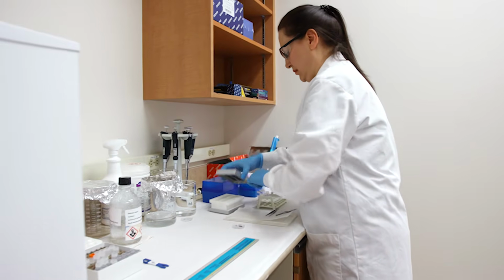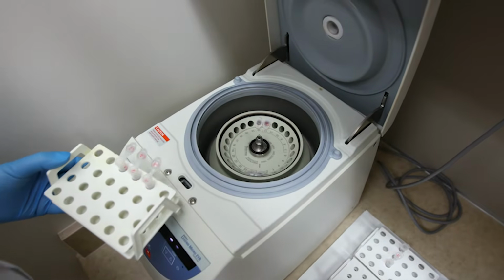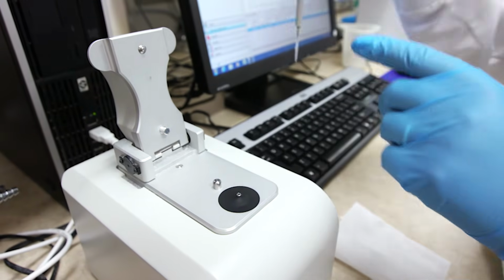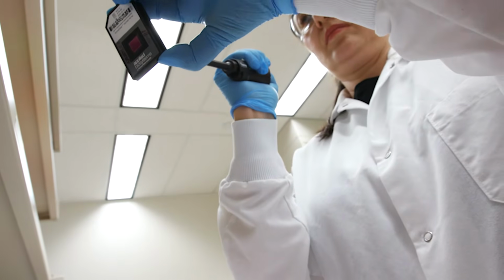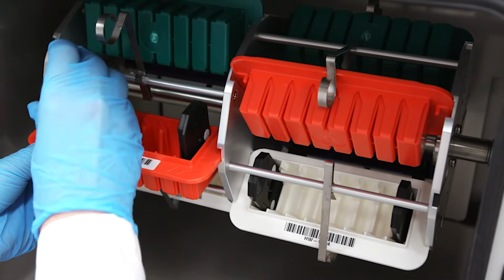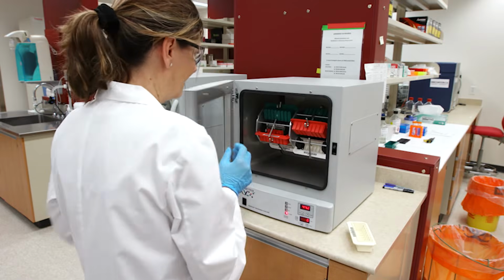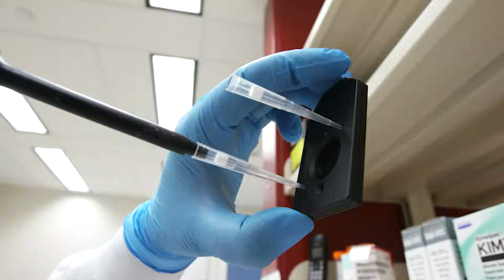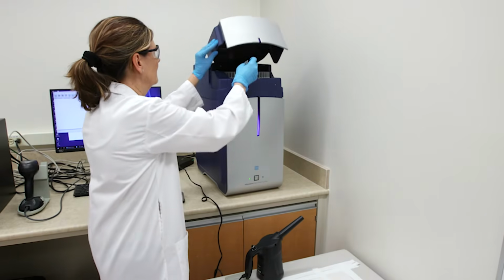We then take that sample, elute the RNA, clean it up, do some quality control tests on it, and then fragment it. So we break the RNA apart into all these little pieces, and then we go through a step called labeling, where we attach a fluorescent label to all of those different fragments. We then pipette the sample onto the chip, and it goes into an oven overnight so that any fragments in that sample that could adhere to one of those DNA fragments on the chip have a chance to stick. And then we take the chip off, wash it, stain it, and scan it with a laser.